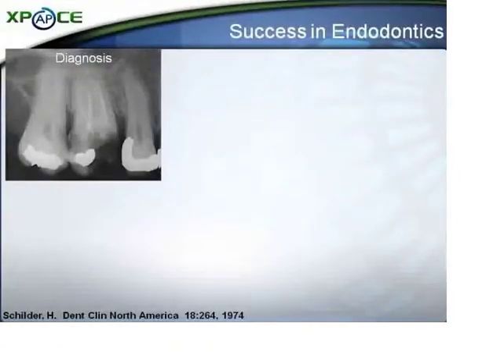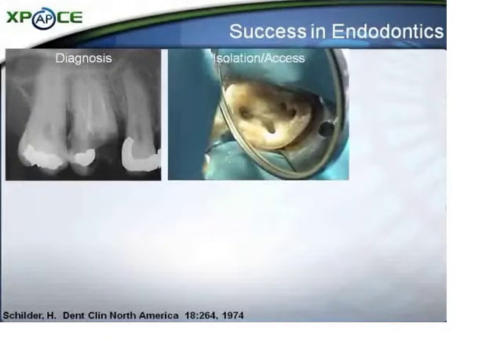All of us are aware that clinical success depends on how we perform each step in endodontic therapy. Success starts with making a proper diagnosis. Once it is determined that a root canal should be performed, it is essential to find and gain access to the canals and to be able to isolate the tooth with a rubber dam.